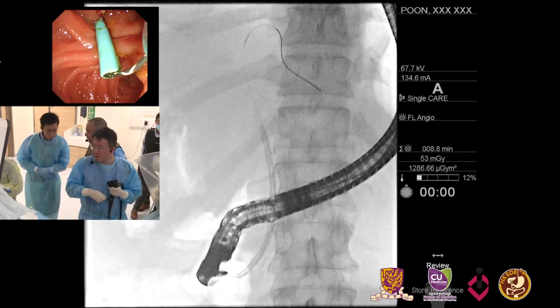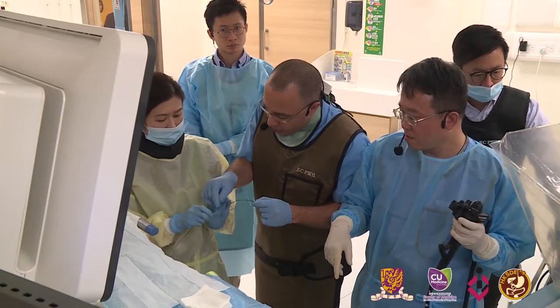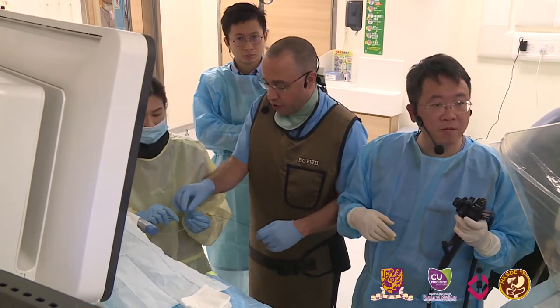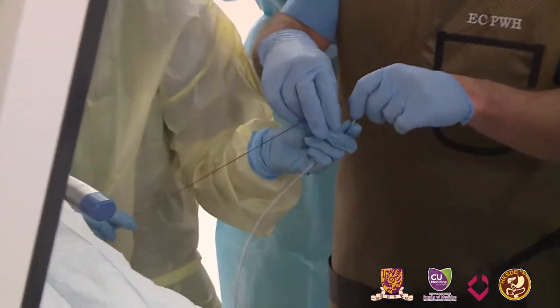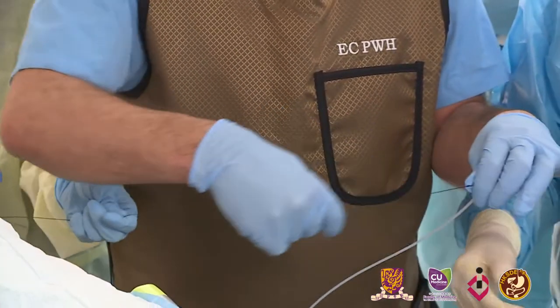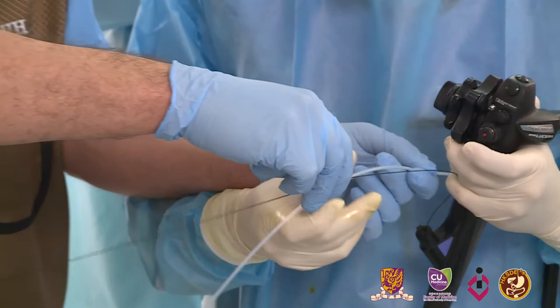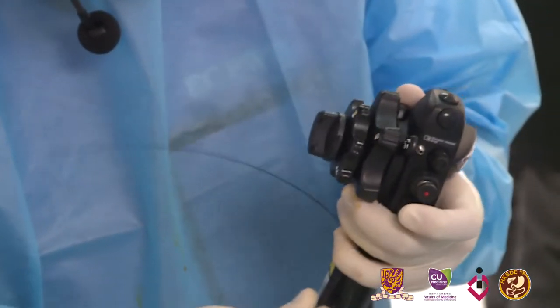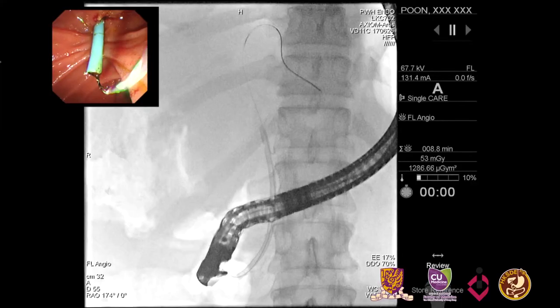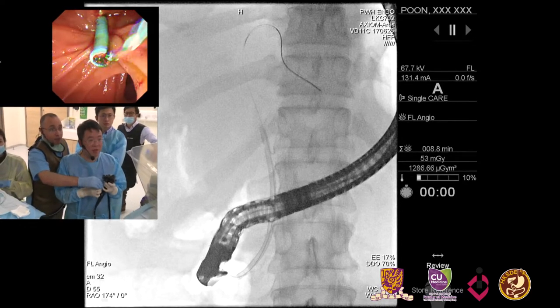Okay. Can we have large gloves? So here, close the snare a little bit. More. Okay, good. So now pull the wire. We put the snare over the guide wire. Just a little tight on the wire, and just as a monorail, he's holding the wire. And I would get close to the stent, because it tends to push it out if you're far away. And here, I think you just need to pull the wire a little bit. Yep, like this.